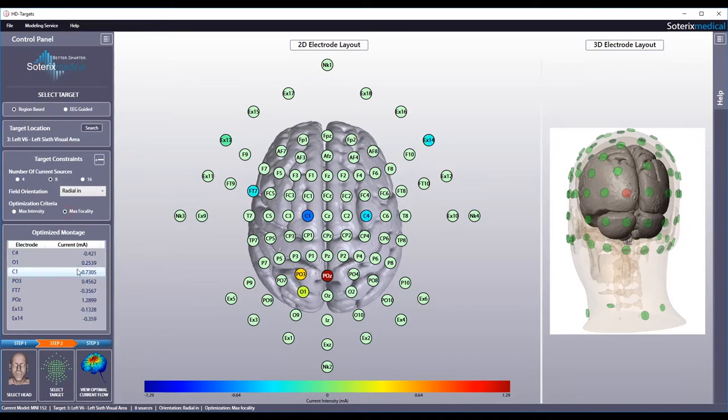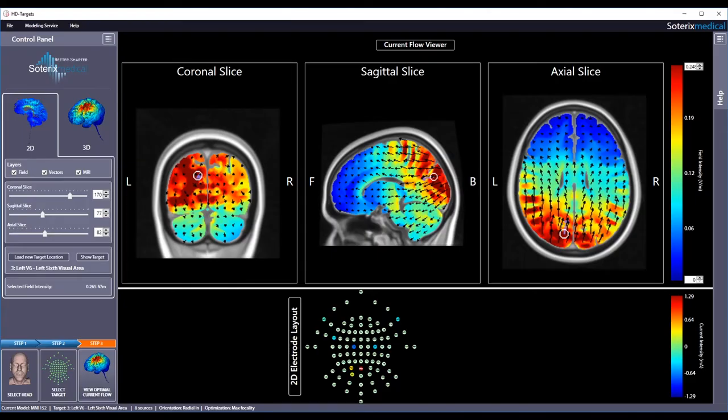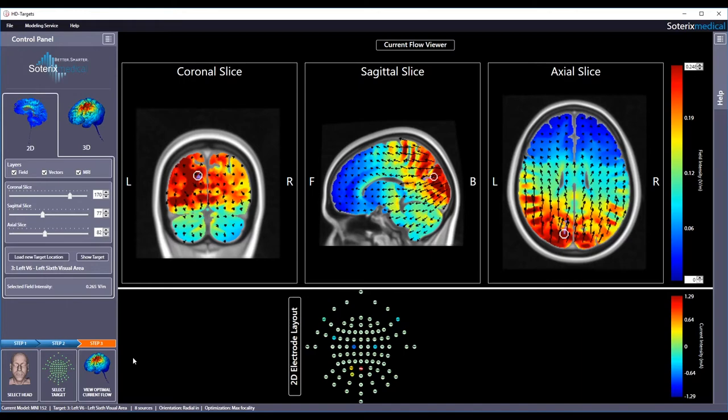To show how a current flows through the brain, hit the view optimal current flow button. Soterics Medical HD Targets now shows you the current flow patterns through the head in both 2D and 3D for the optimized electrode montage. The default view in 2D shows current flow for 3 different views in false color, with 0 indicating no current and red indicating the maximum current with the electric field intensity indicated.